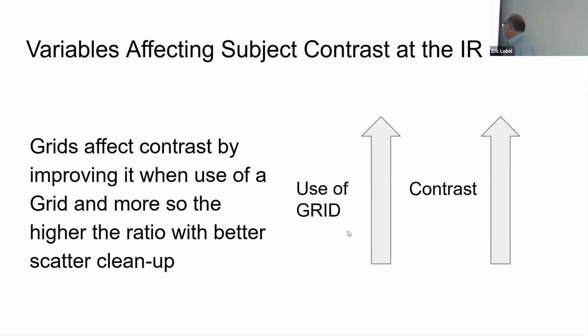Unless we get rid of the grids and, like we were saying, the mathematical noise reduction algorithms really kick in in a big way, and then we don't need to use a grid at all. Then we would not have to worry about grid lines. We would not have to worry about anything heavy. We would not have to slip on anything. And if you played with that thing, it's like a big pain, isn't it? It takes like 2 people to put the grid on in the lab. It's not optimal, right? So life would be better.